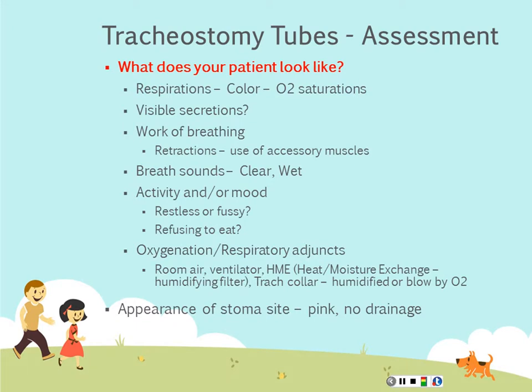When you put your stethoscope onto their chest and auscultate, are the breath sounds clear? Do you hear crackles, rhonchi, things like that?